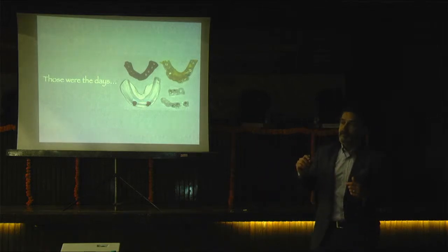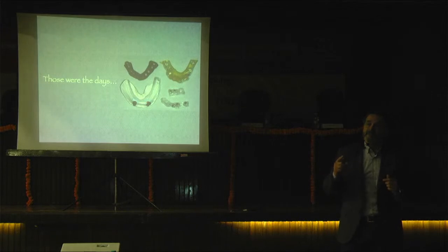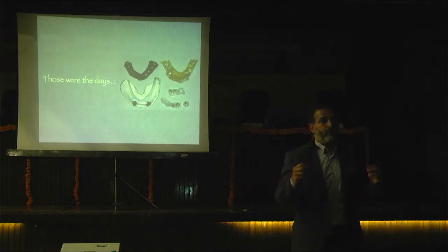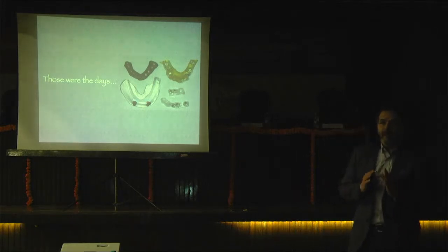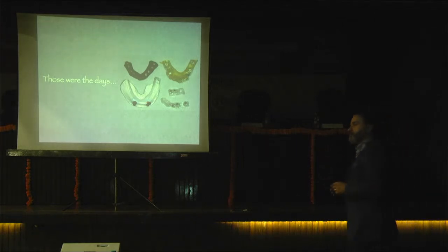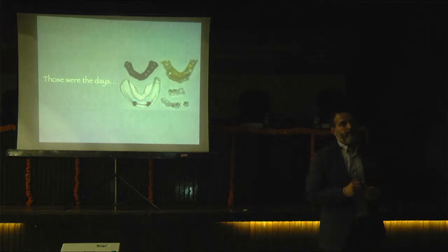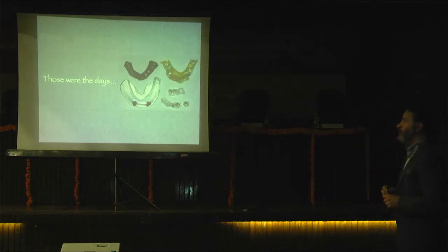And after that, he decides to do or not to start anything. Why? Because there are so many parameters. And then, after implants came into our lives, they created some stents, and I respect them. Now we don't use this kind of stents, but we have to respect the work and the experience that they spent on this issue.